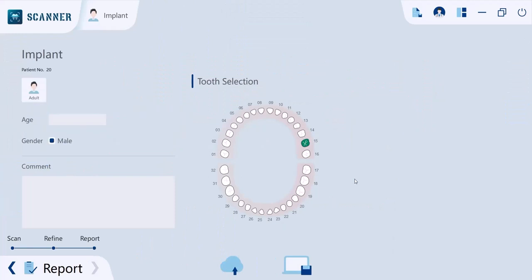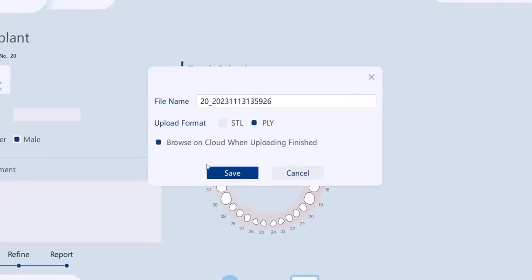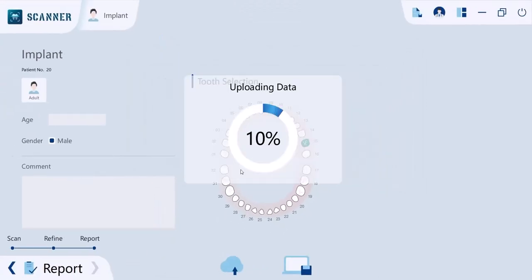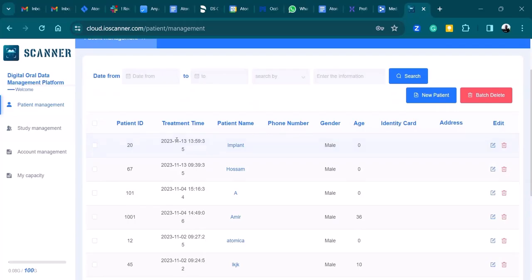Finally, you can export the model in both STL and PLY live formats, then save to your disk or on cloud storage so that you can access your patient data anywhere, anytime.